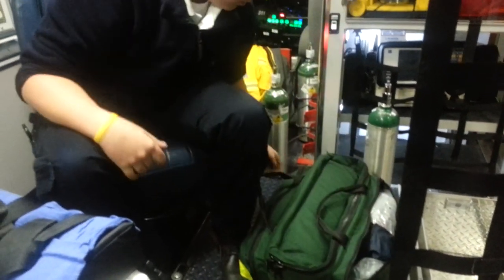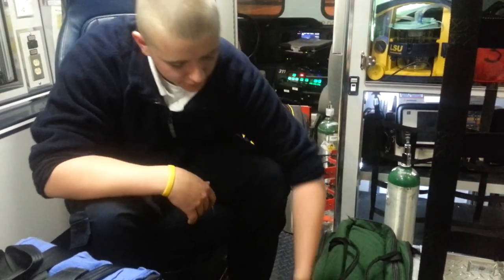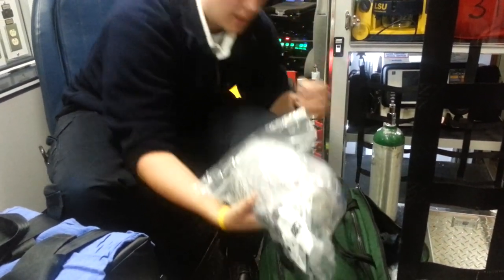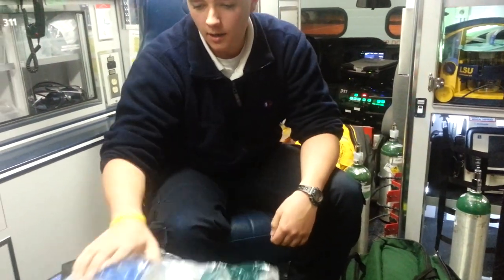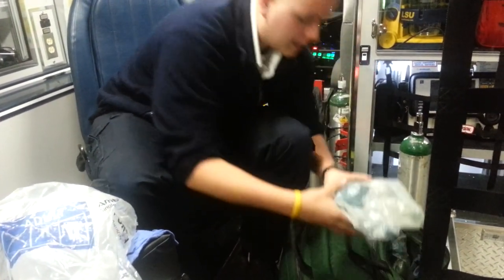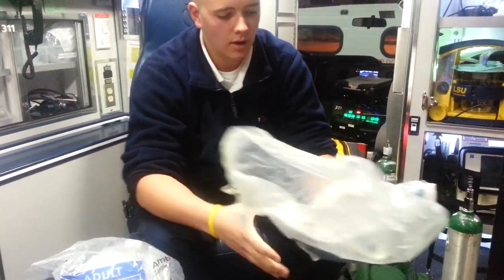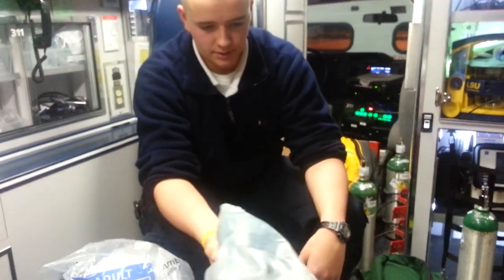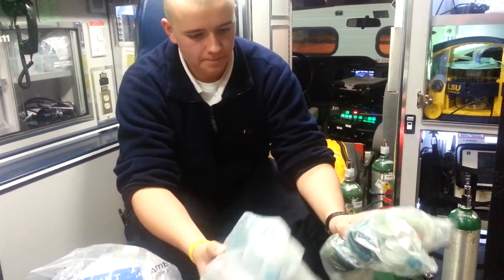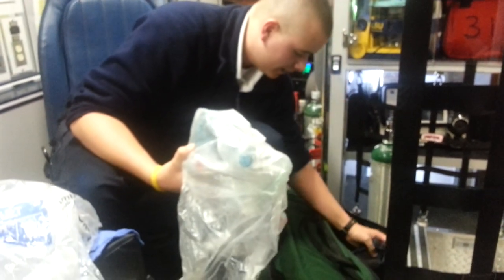One pocket will have all the small stuff such as airways and the BP cuff stethoscope, and the other side will have the three BVMs you need to have in each. You have your large adult size — it says adult in big letters. Then you have an intermediate size for child. And then we have the smaller infant or baby BVM. Also in here there's a bulb syringe and pocket masks.